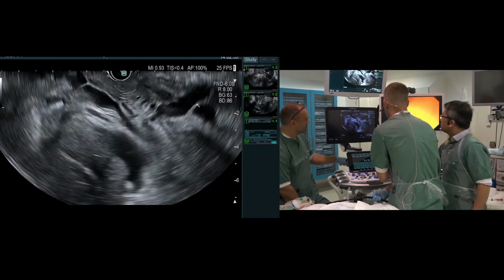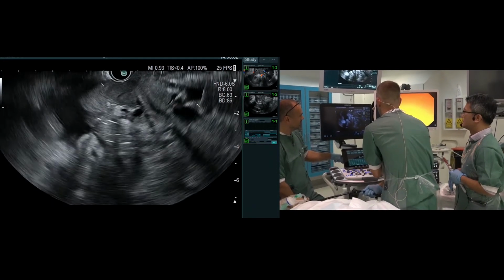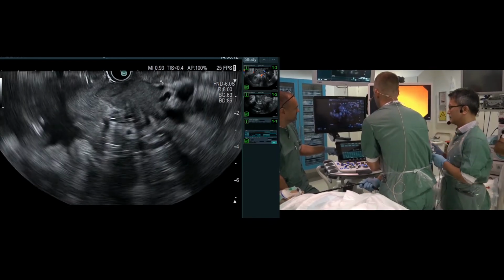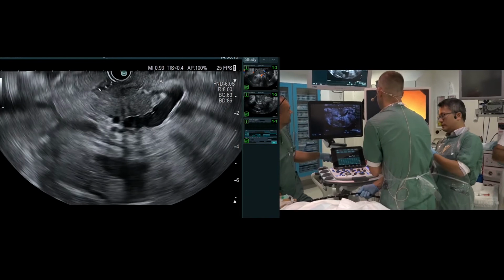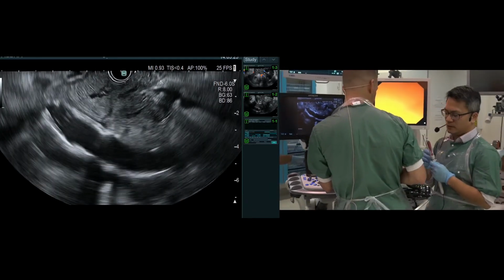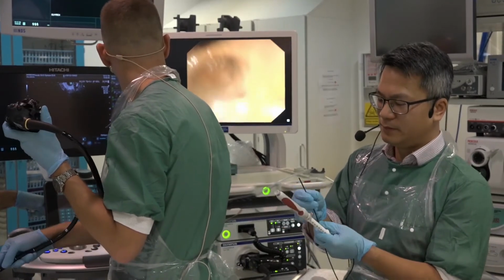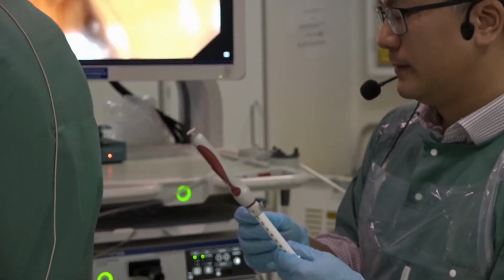So we'll now, because we would like to demonstrate to you 2 needles. Actually, they are both biopsy needles, so you can appreciate the cancer, the tumor now between the transducer and the dilated pancreatic duct. So I'll start, we would like to show you two needles. The first one will be, again, here now you see the cancer and the pancreatic duct dilated above it. So the first needle, maybe Khan can show you, what I have here is the new Cook Procore 20 gauge. And it is a little bit thicker than the previous ones, and it's a forward cutting compared to the previous models.